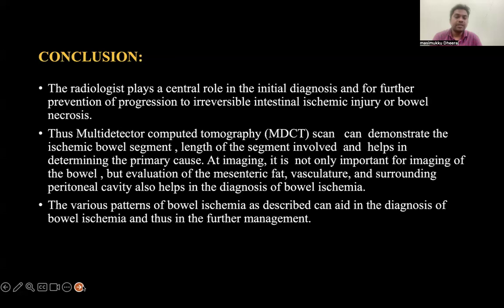Conclusion: the radiologist plays a central role in the initial diagnosis and in further prevention of progression to irreversible intestinal ischemic injury or bowel necrosis. Thus, multi-detector computed tomography scan can demonstrate the ischemic bowel segment, length of the segment involved, and helps in determining the primary cause.